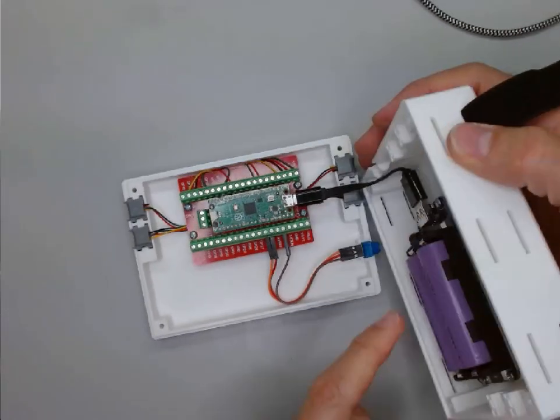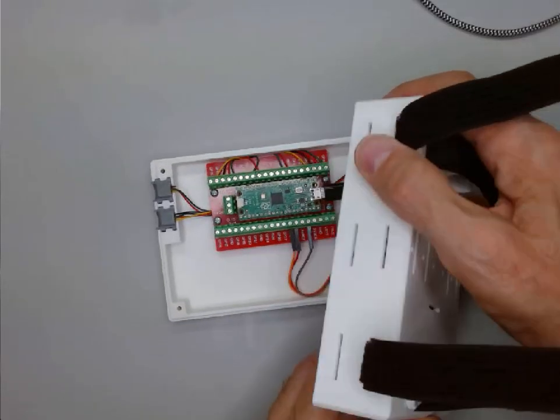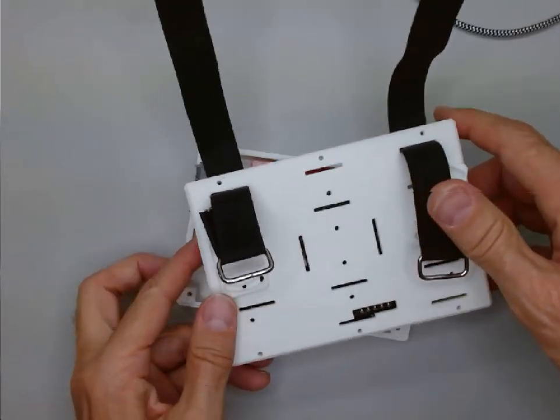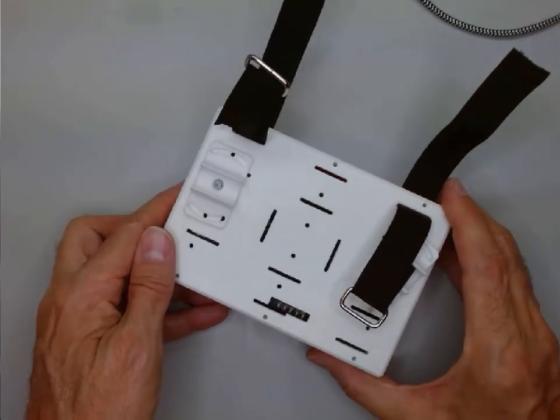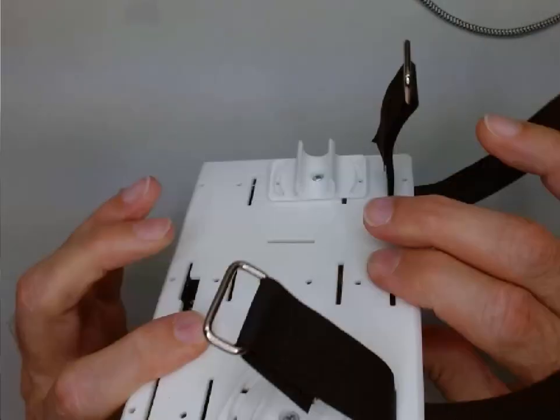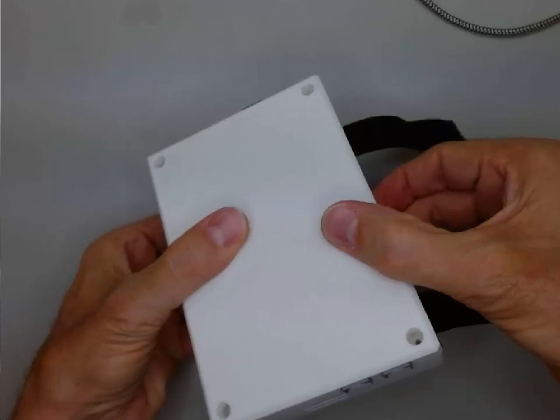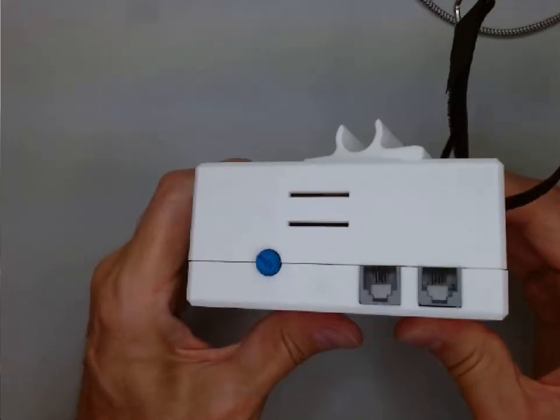rotate a little bit. I want the battery packs down in this area here. So I'll turn it and set it on top of the other half. Squeeze it together. Make sure I haven't got anything sticking out around these seams.